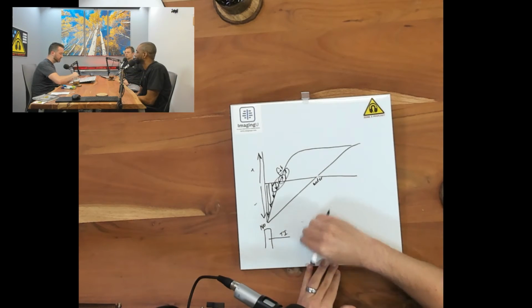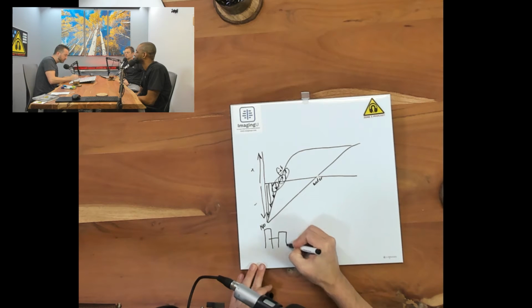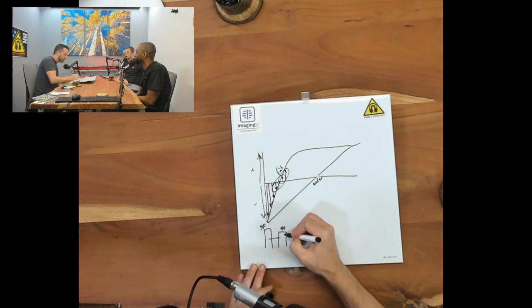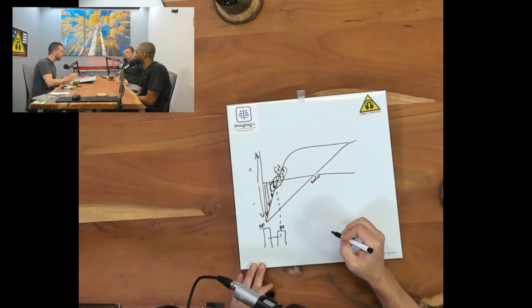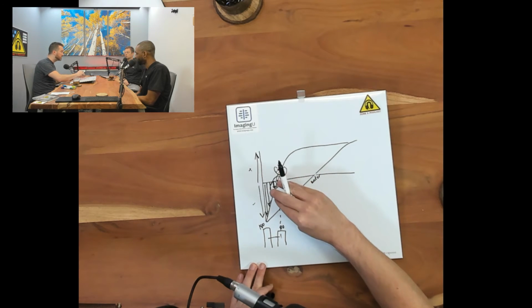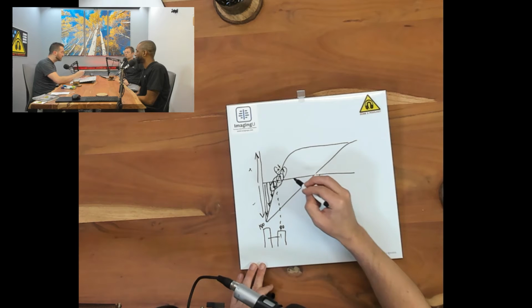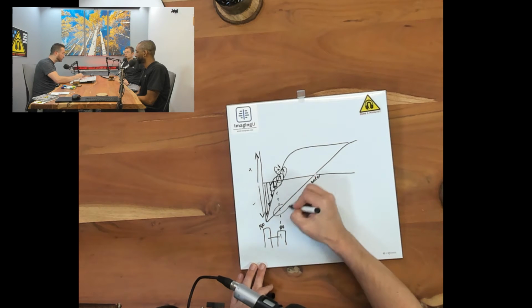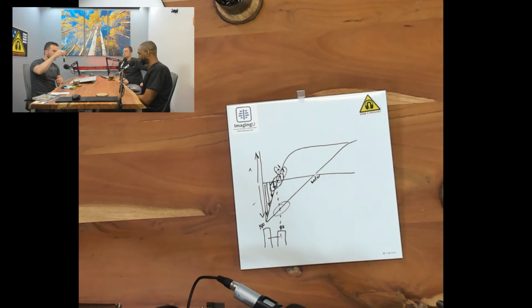So if I was trying to do a STIR here, I'd have my TI right around here. That way there is zero fat at that point, no positive or negative amount of T1 recovery, or longitudinal magnetization. And so that 90 degree pulse has plenty of water that's going to flip into the transverse plane. Because even if something's negative and regrowing, if I hit it with a 90 at that point, it's still going to go around in the transverse plane.